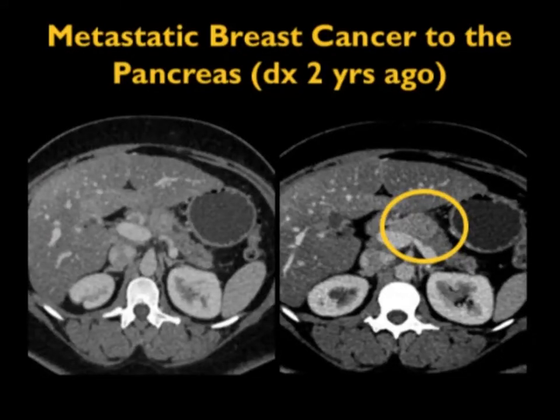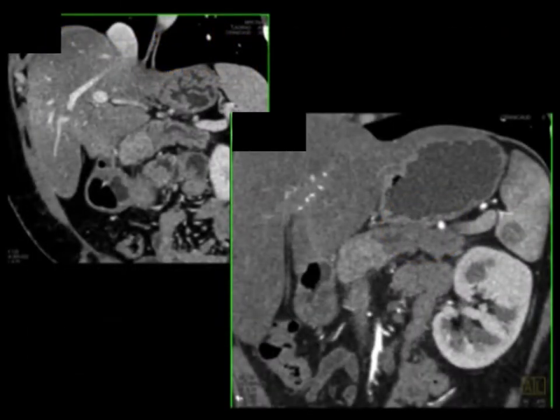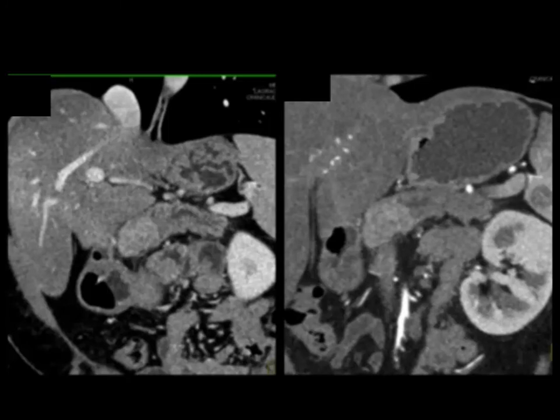You see a dilated pancreatic duct and what looks like increased density of a mass. Now you might think even about a neuroendocrine tumor, but pancreas can get metastasis from breast. It's a possibility. I think it would be a hard call in this case. You still might think of an atypical adenocarcinoma or neuroendocrine tumor, but Mets would be in the ballpark. But I have to admit, it looks like a primary pancreatic cancer.